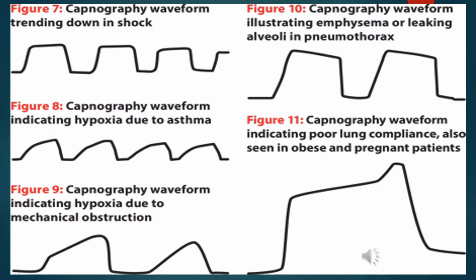Instead of the end-tidal part where we had the circle on the previous graph at the very edge of the waveform, you can see it's decelerated. That's because the end reading is not as high as the beginning phase of the exhalation. So these are the minute differences that you can observe based on the type of waveform.